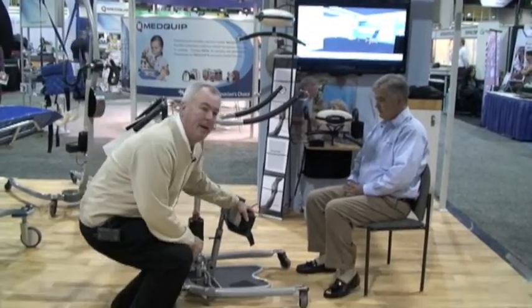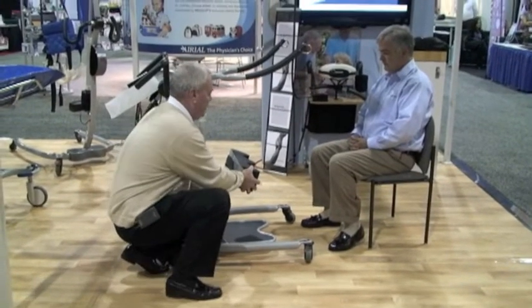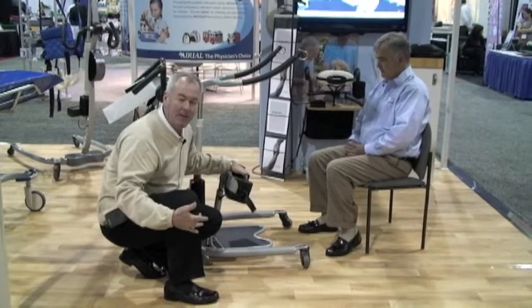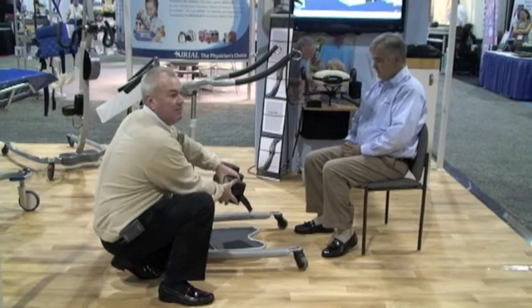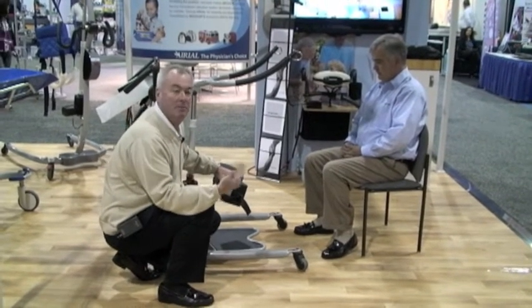Down here in the knee pad area, this is height adjustable, so we can actually loosen this and lower it down. We always want to try to keep the knee pad below the kneecap when standing people up. It's also flexible, so it does flex ergonomically in the right position.